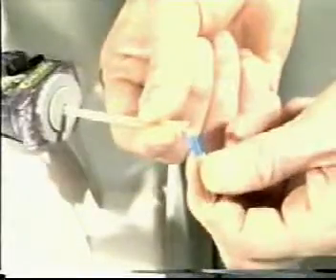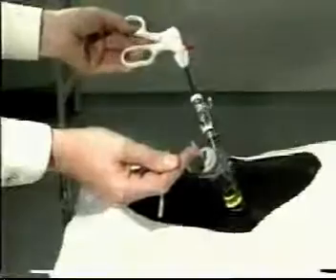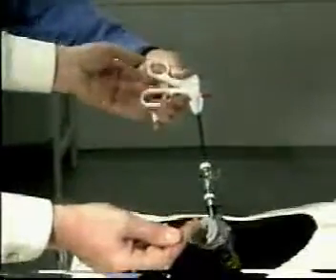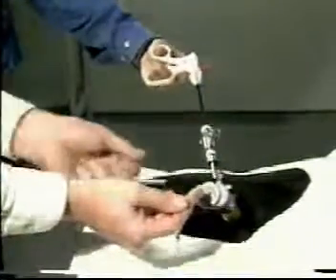Once you have the loop at the base of the appendix, grasp it and then tighten the loop by breaking off the end of the endoloop and pulling back on the thread. To allow you to do this, get your assistant to hold the graspers. Pull on the thread at the same time as tightening the knot with the shaft of the endoloop until the knot is secure and tight around the base of the appendix.